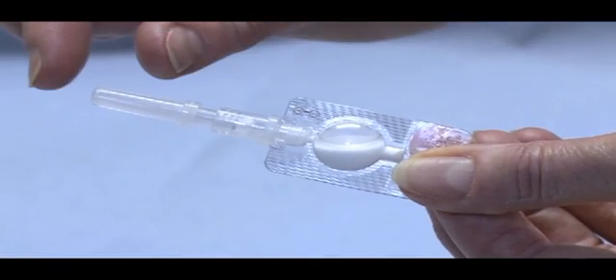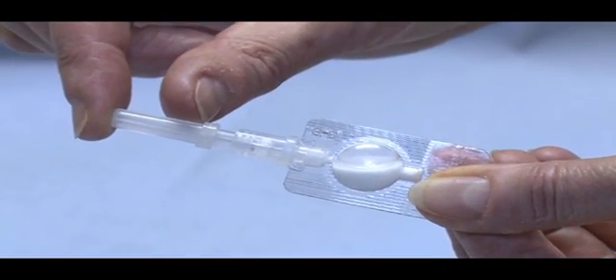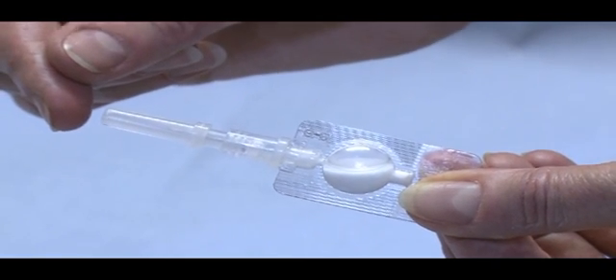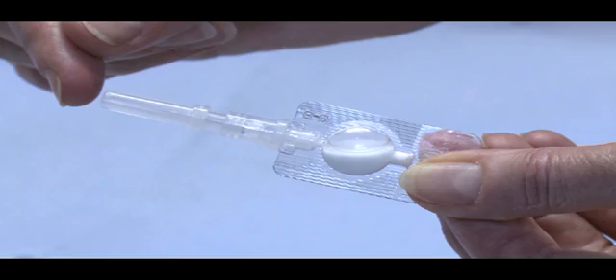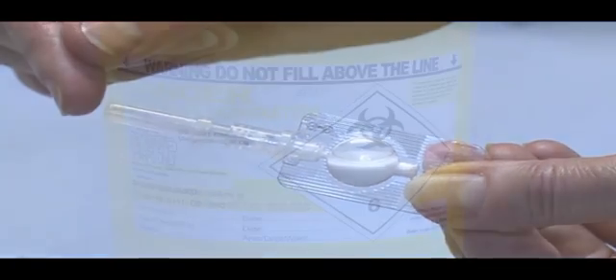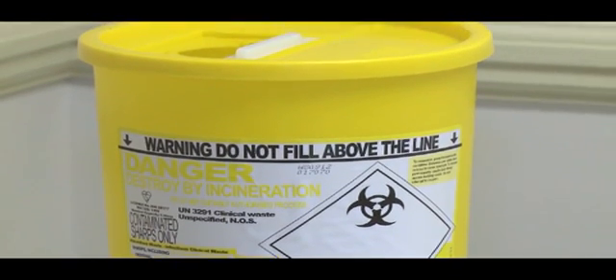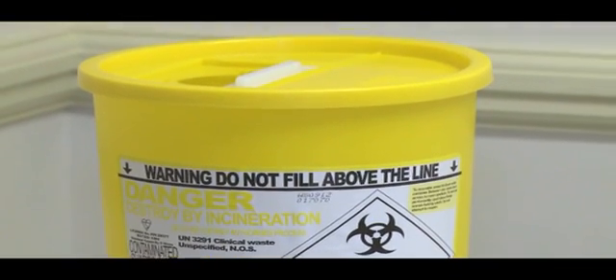The needle shield should be in place as shown here. If for any reason it has come off or is missing altogether, you must discard the injector and use a new one. It is important to remember that you should discard any injectors according to local guidance for disposal of sharps.